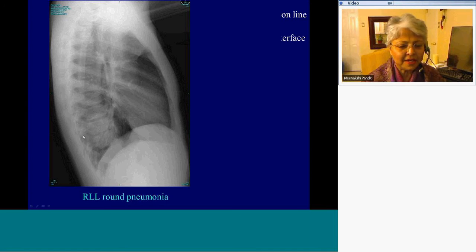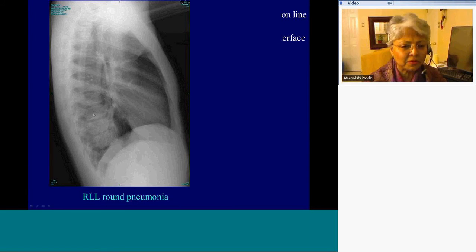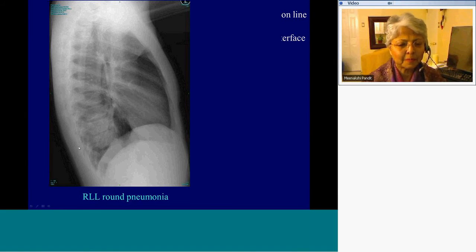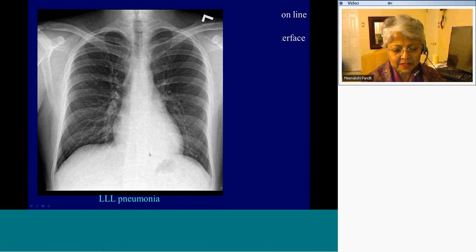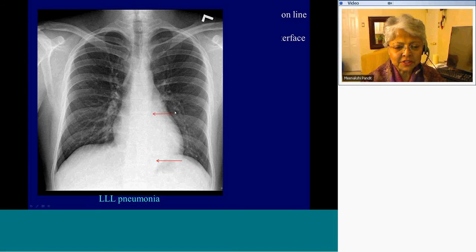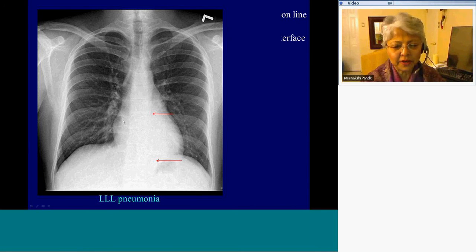Again, as demonstrated, here is the positive spine sign, where there is an increase in density followed by lucency as we go up the spine. There is a left lower lobe pneumonia. The posterior basal segment is denser when compared to the right side, and there is silhouetting of the descending thoracic aorta — you cannot trace it beyond that point.